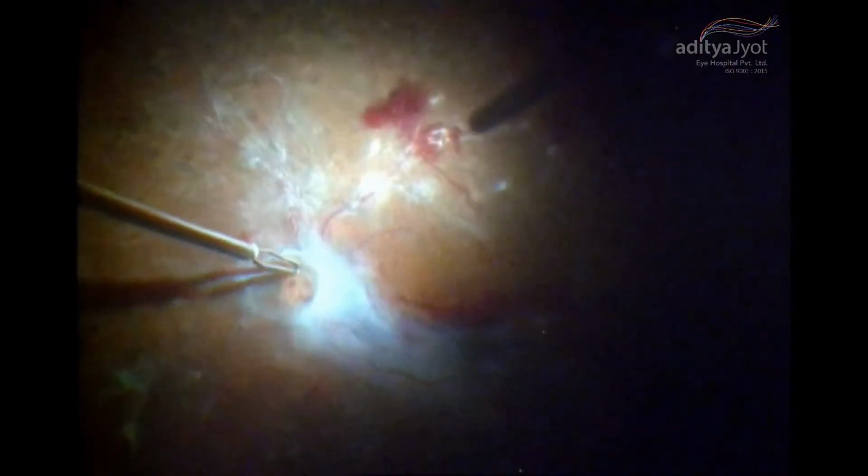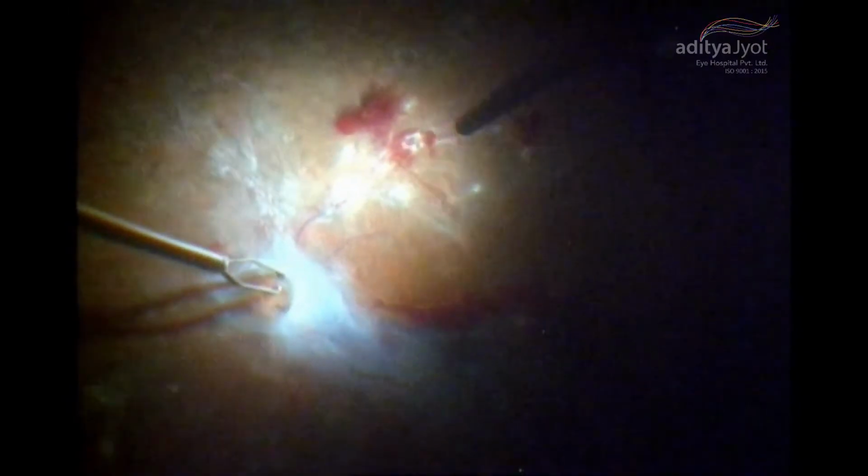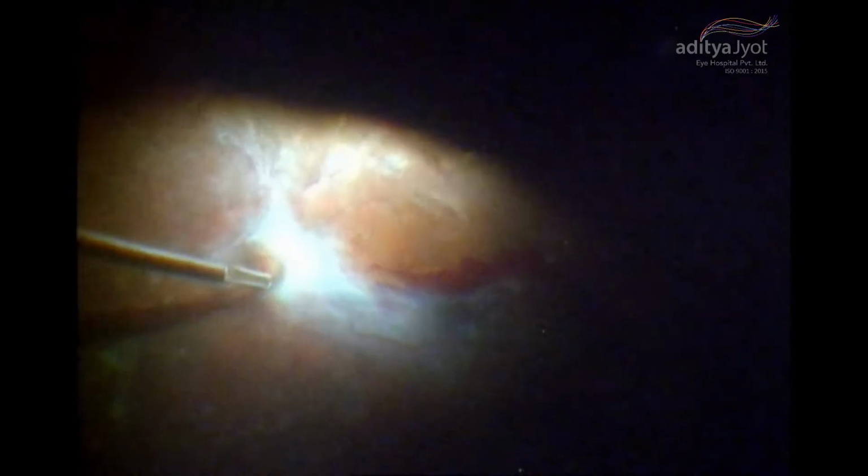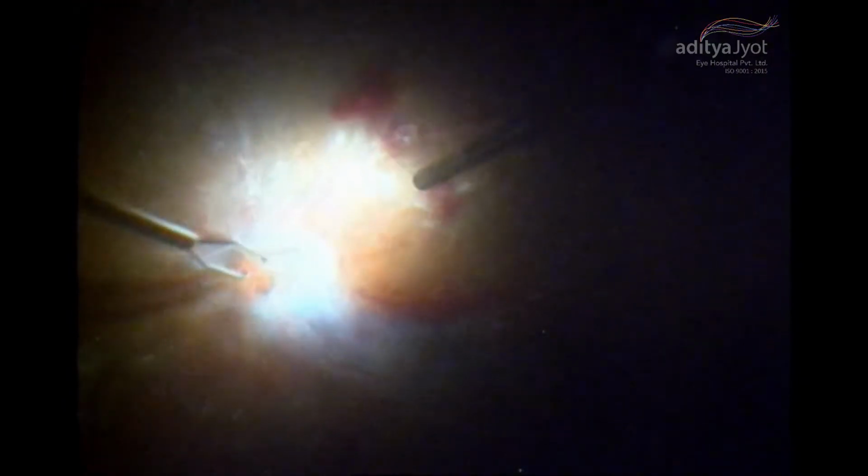And you can see now the transparent part of the posterior vitreous surface, and now I'm using the forceps to catch the vitreous membrane, which I'm trying to do while understanding the tactile sensation through the forceps, to make sure that I don't pull too much and I don't produce extra traction, which will produce an iatrogenic retinal break.